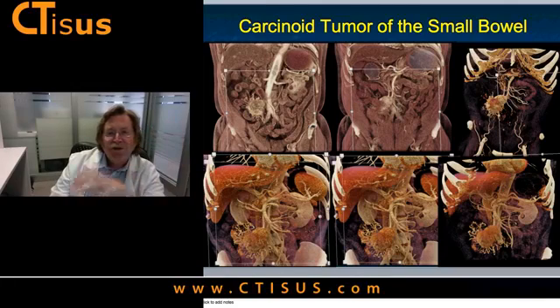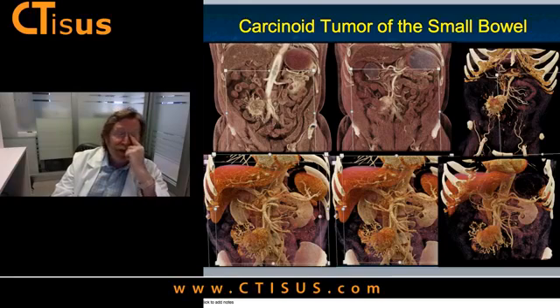I think what you're going to see when we talk about radiology 3.0, radiology value, this is much more than just dictating a report. These are value images, because whether you're speaking to the patient and showing them, whether you're speaking to the surgeon, whether you're doing pre-op planning or follow-up, it's within the volume that everything is happening and all knowledge is. The question is, how do you use this information to improve the detection and management and differential diagnosis of tumors? How do we put this into the deep learning?